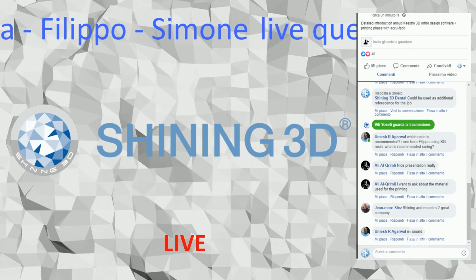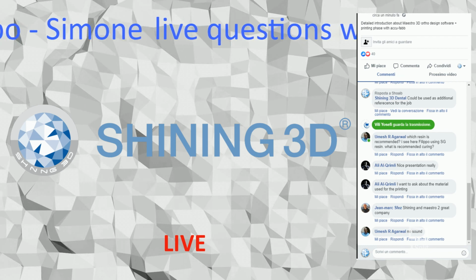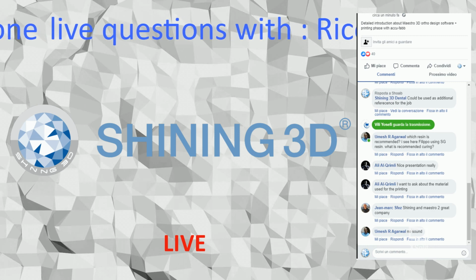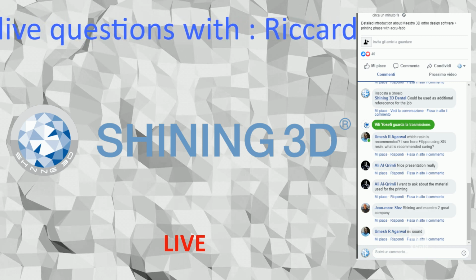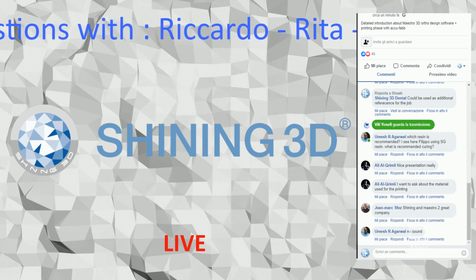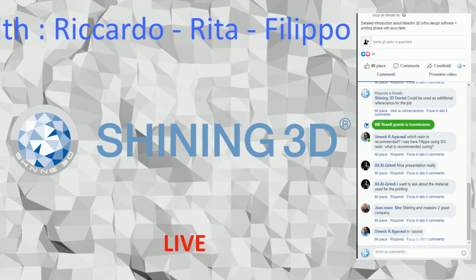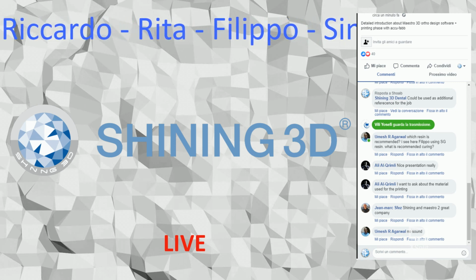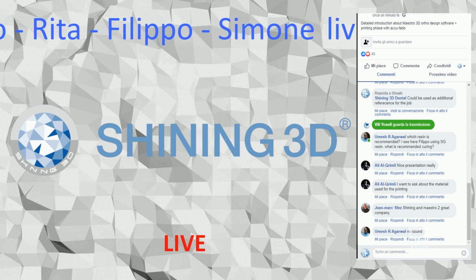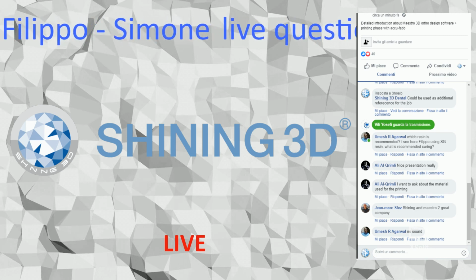So I can see some questions. Nice presentation, really, thank you very much. I want to ask about the material used for the printing. Okay, regarding the material, just consider that we are testing some prototypes and making some tests with the materials, so it is not something that we can already recommend. The purpose of the video was to show the workflow and to see what you are able to do. Then for further details regarding the material, we can contact you in the following days and weeks to provide more specific information about that.